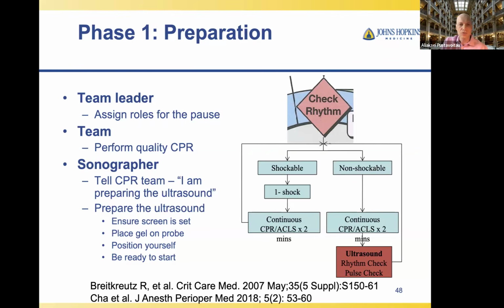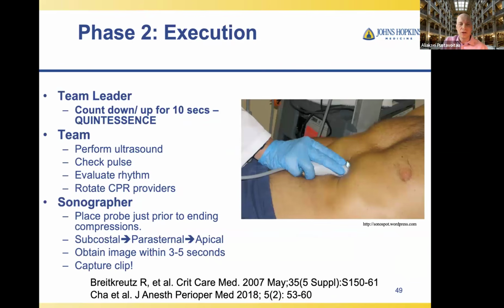So everyone is getting ready. And right before the pause is announced, the team leader, or someone who helps manage the pause, announces, okay, hold CPR, start the rhythm pulse check. The sonographer will already be on the chest with the probe, and as soon as the team leader announces that, they start obtaining images.